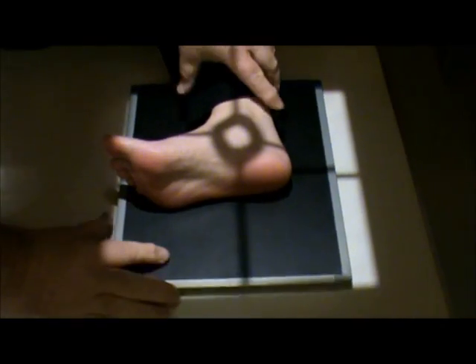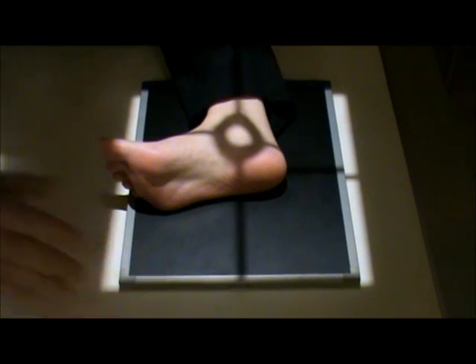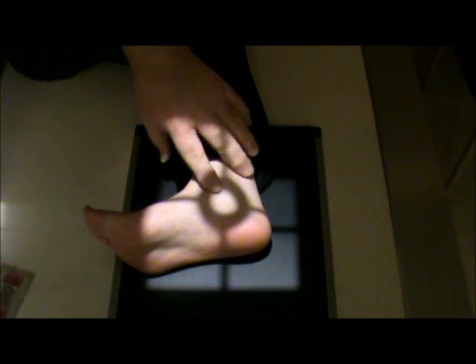I'm going to make sure I'm centered to my film, opening up the collimation both ways to confirm centering, then collimate back down. As far as our collimation on this, we need to include the entire calcaneus. We're going to see up about an inch of the distal tip of the fibula. We also need to get to the base of the fifth metatarsal, which is a common fracture site in the foot, so we want to make sure all of that is included.